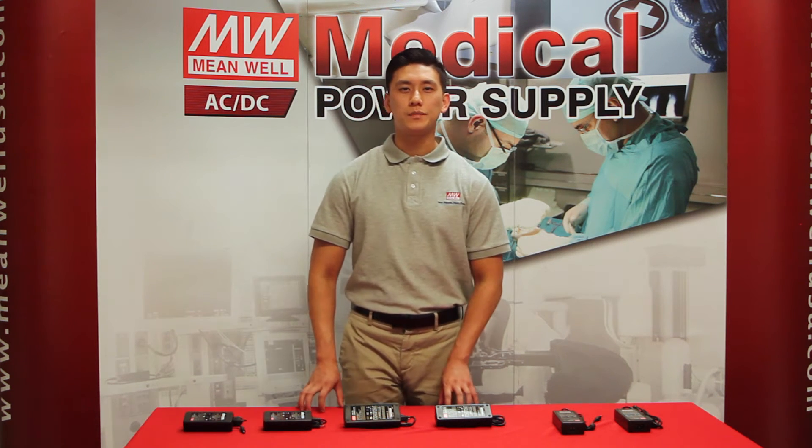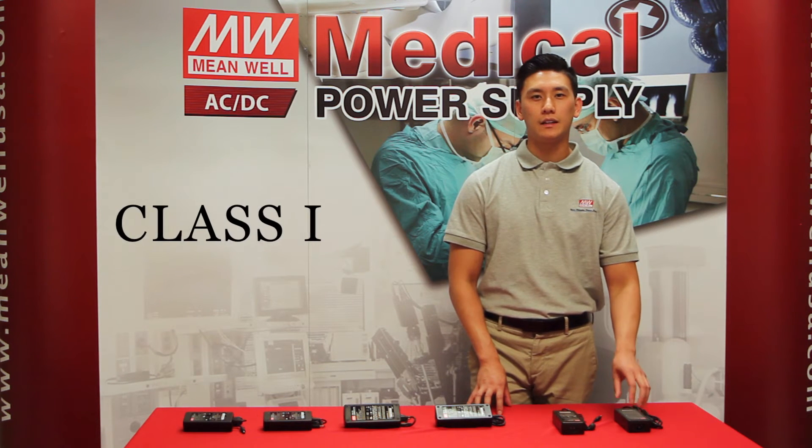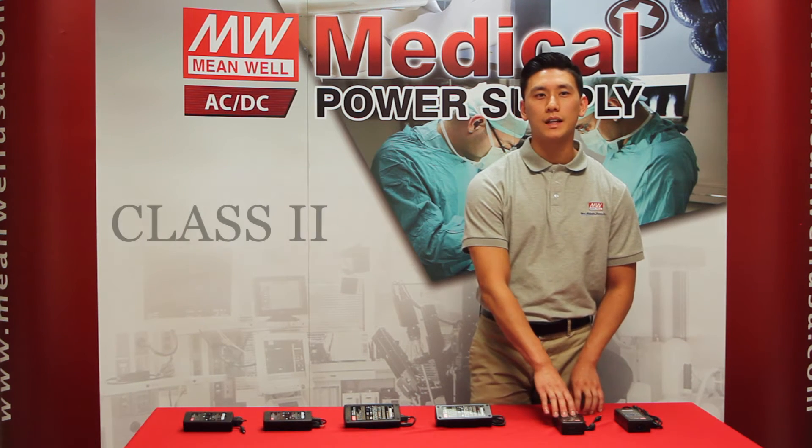The GSM series comes in two different types. Over here we have an A type and a B type. The A type is a class 1 with a 3-pole input and it also comes with a safety ground pin. The B type is a class 2 — it's a 2-pole input without a safety ground pin.